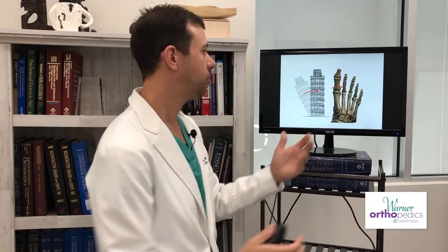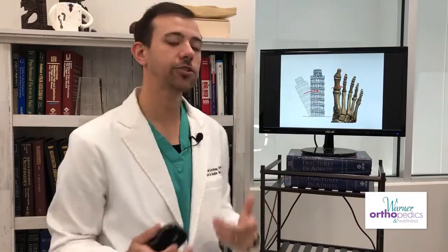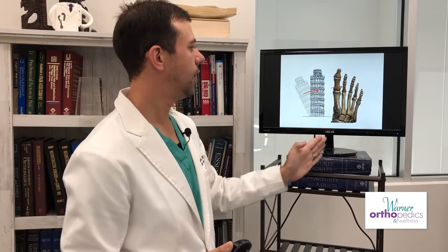This is typical for a LAPIPLASTY procedure. So if you can see, what we're doing is we're actually correcting the bunion from the foundation, from its origin, which is at the base of the tarsal metatarsal joint, of the first tarsal metatarsal joint. So now you can see the metatarsal tends to line up correctly. It's parallel to the second metatarsal.